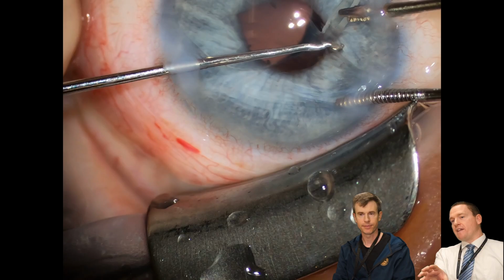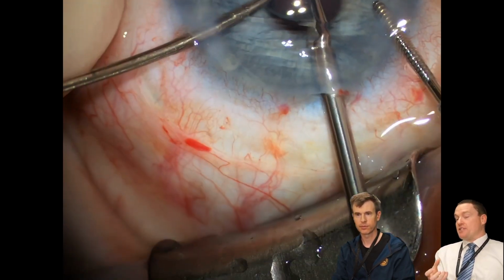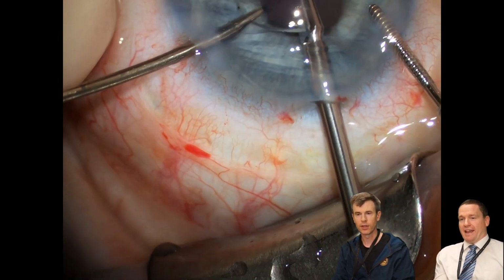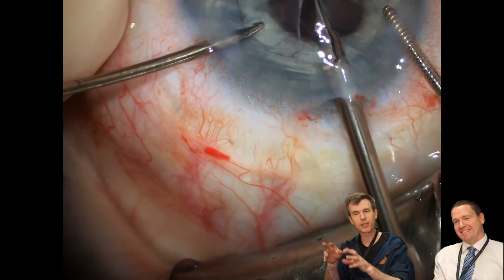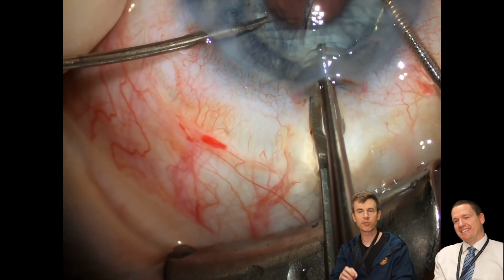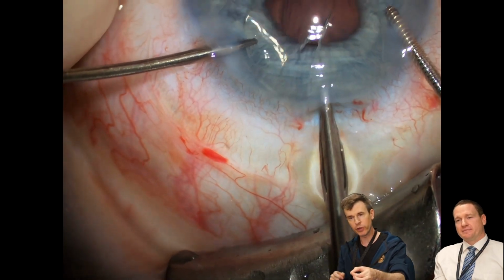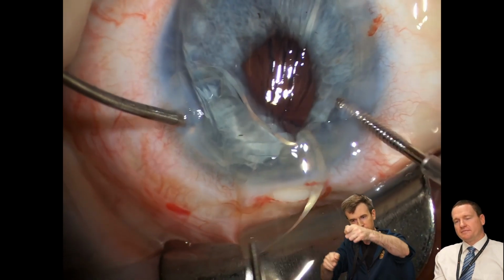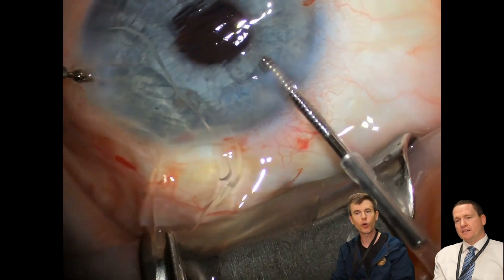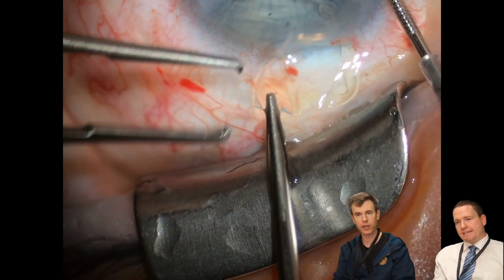Now, you're probably feeling a little better because the lens is starting to get into the anterior chamber here, so getting a firm grip on that. But you can see by how decentered it is that I was trying to work as efficiently as I can. Here I'm cutting the lens in two and removing it from the eye, but partially separating it, holding it so that it gets in two pieces and gets torqued out of the wound, kind of turned out slowly.